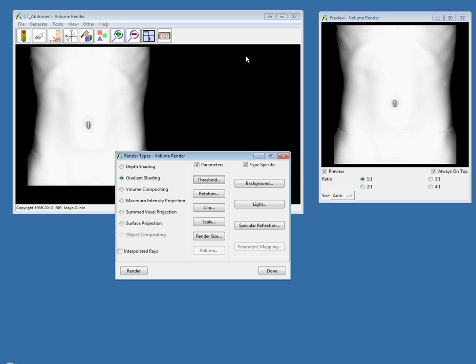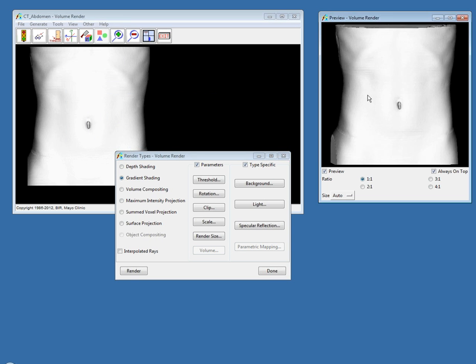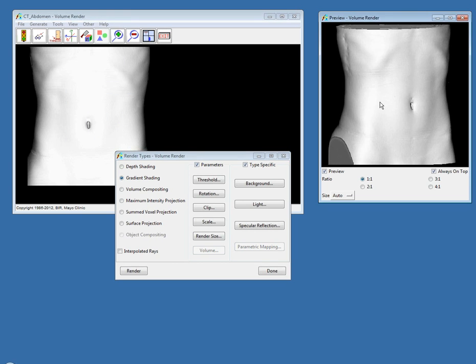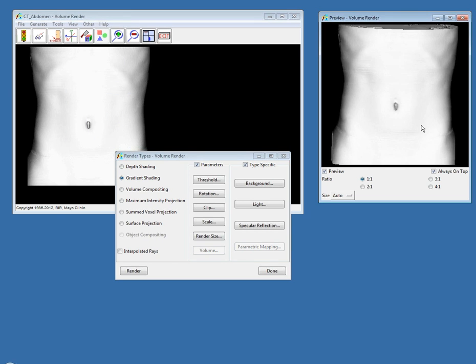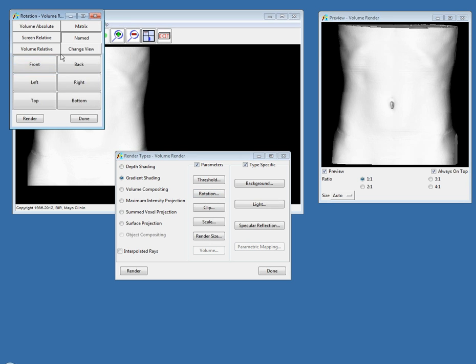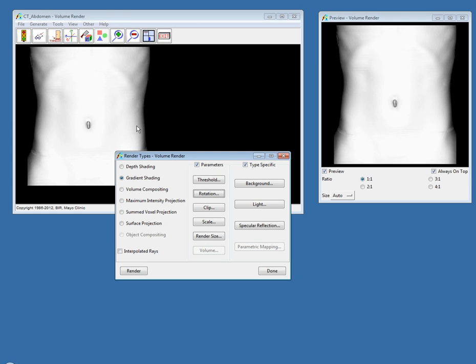Another new option in Analyze 11.0 is that you can rotate directly from the Preview window. You can just drag and drop and move your rendering around quickly. You can still get quick access to the original Rotation window directly from the Render Type window. I hit Rotation and can reset back to my original view.